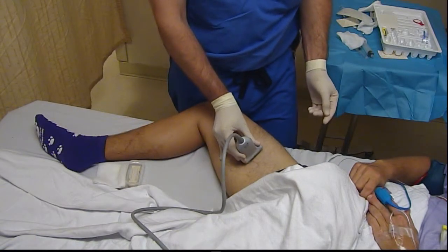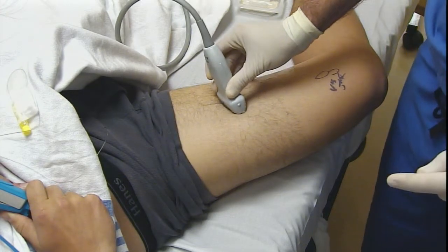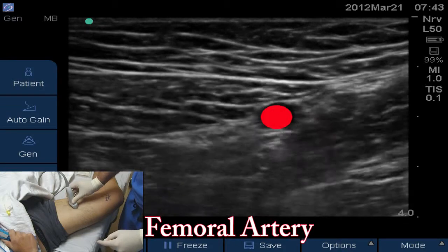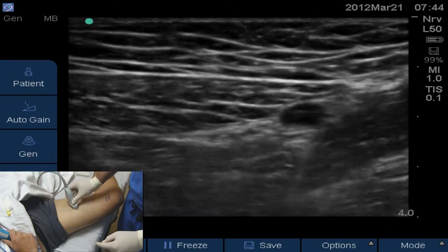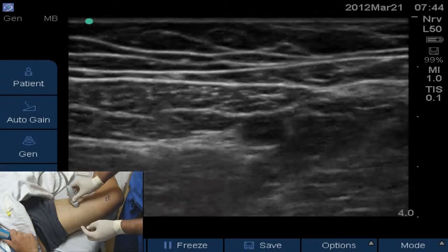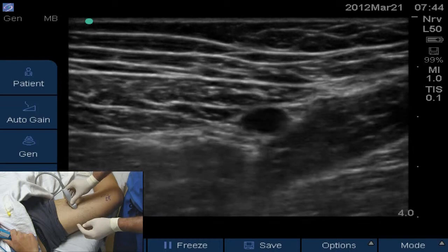We'll start about mid-thigh in our scan for the saphenous nerve. The two identifying landmarks we're looking for are the sartorius muscle and the femoral artery. Notice you can see the pulsatile femoral artery in the middle of the screen, and just superficial to that — above that artery in almost a baleen whale shape — is the sartorius muscle. I'm going to scan down the leg until the artery starts to dive away from the sartorius muscle, then back up until it's just under the sartorius. At that distal-most location where I see the artery just deep to the muscle, that's where I want to block the saphenous nerve. You can see his saphenous nerve pretty clearly.